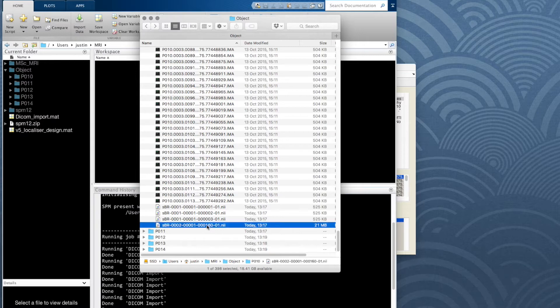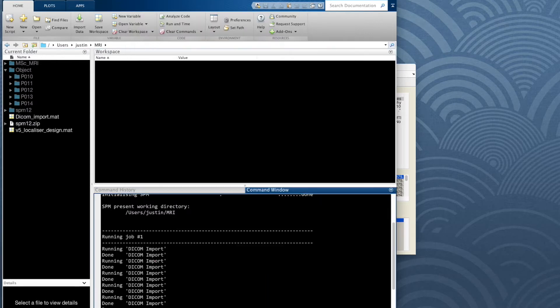It's this last one with the 160 that's interesting. It's a very large image because this is the one millimeter resolution T1 anatomical structural image, which we got as 160 separate DICOM images — each a separate transverse slice — which the DICOM conversion has put together into one three-dimensional image volume. This should work fine with no problems, but it's always a good idea to have a look at your images to check everything is okay.